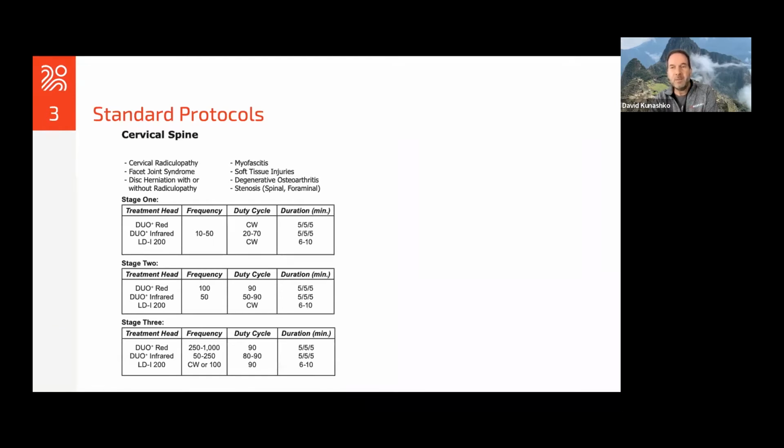They look at it as if, well, this is something that you guys are marketing or saying it's effective for, and yet the research isn't necessarily correlating with that. Now, we know clinically it's very effective for many conditions because they're inflammatory in nature. And we know that the mechanism of action, it reduces inflammation. But of course, the regulatory body is a little bit stricter, and they do require very specific approval guidelines in order to put them into the software. So that's why you may or may not see some protocols that aren't in the software, depending where you live.